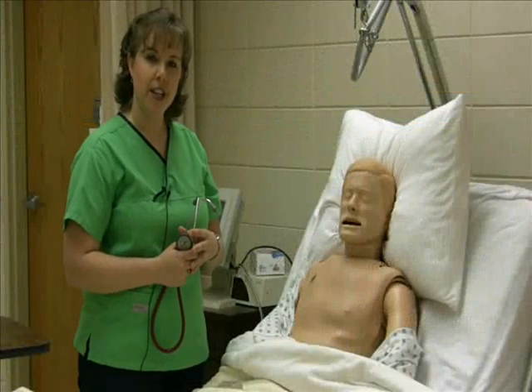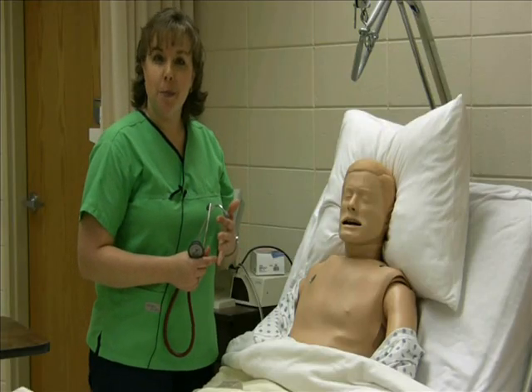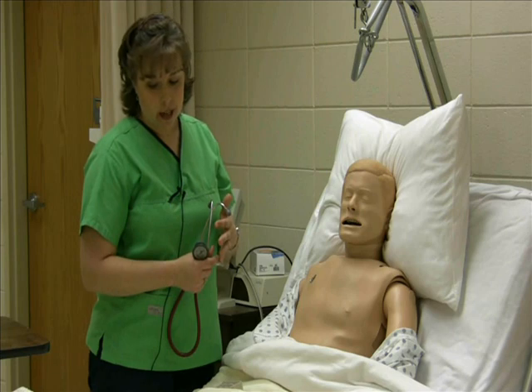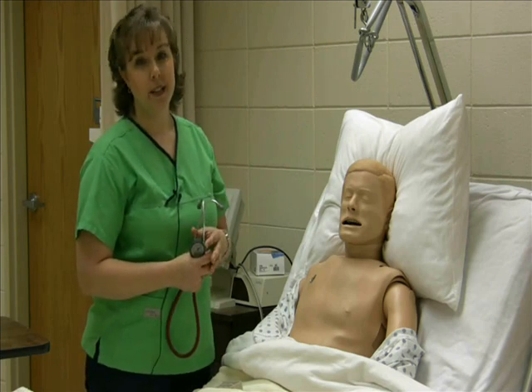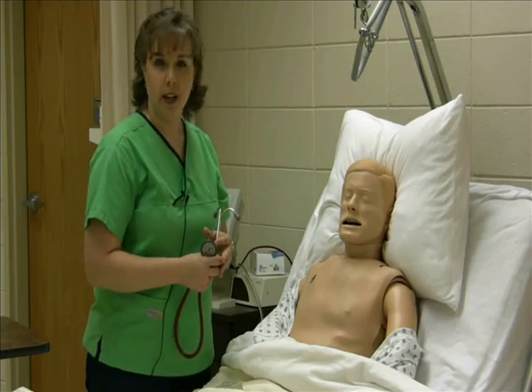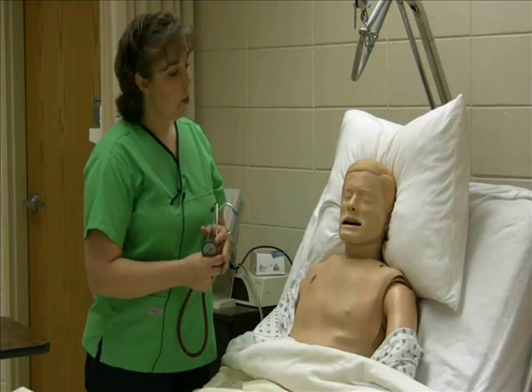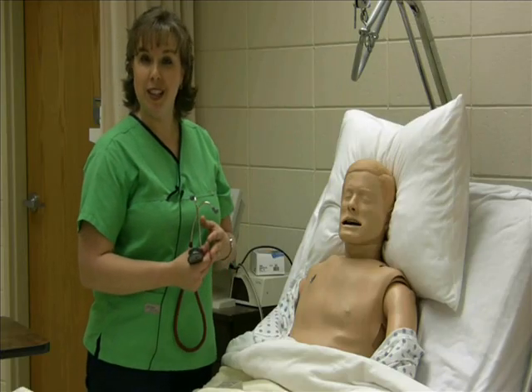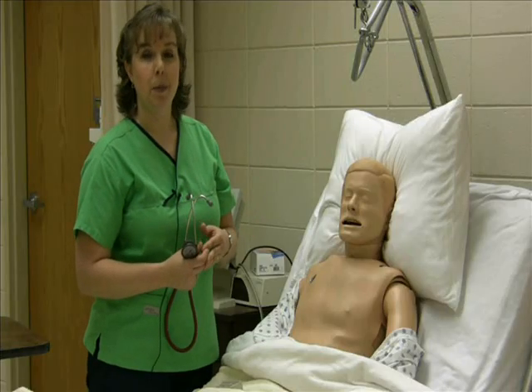As you are listening to the heart, it's going to be important that you assess the rhythm. Is the heart rhythm regular or irregular? When you are listening to the heart rate, to fully assess it well, it needs to be listened to for a full minute, especially if it is irregular. You need to make sure that you are getting an accurate count. The rate of the heart is something else we need to document. That is the speed at which it beats per minute.